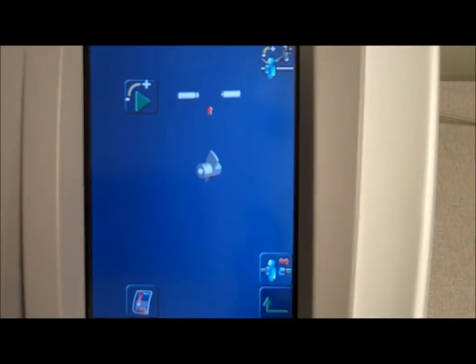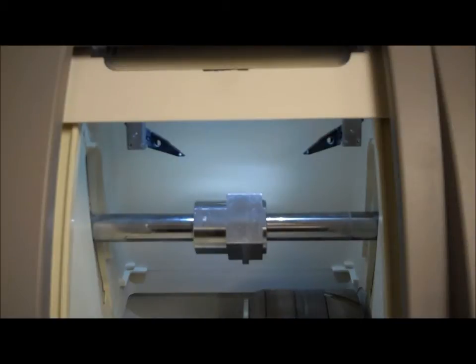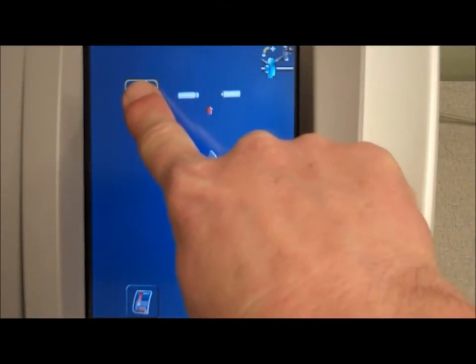Select and hold the clamp icon. The clamping shaft will engage the tool. Select the play icon to start the automatic calibration process.